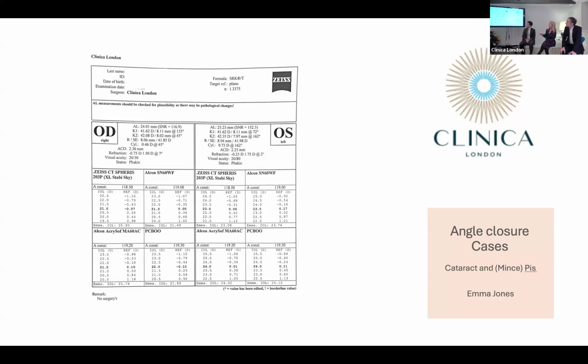And the other thing to say, because he wants to play tennis, even though he's a bit amblyopic and stuff, we do put extended depth of focus and multifocal lenses in patients who are the right patients for that. I know you do lots of multifocals and extended depth of focus. This patient, when he does have his lens removed, is going to have an advantage, maybe his tennis play is going to get better if he wants that extended depth of focus. He's not sure, but because of his competitiveness, he's thinking maybe he wants that advantage with his tennis playing now, and to have his lenses taken out. He was looking at all the websites, and as he's a journalist, thinking, oh, this is an opportunity for me now.